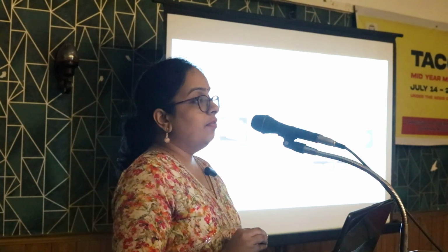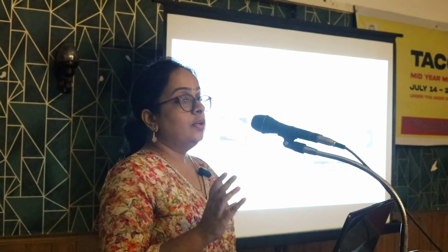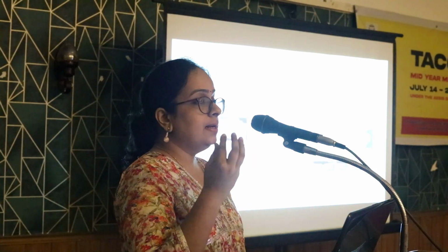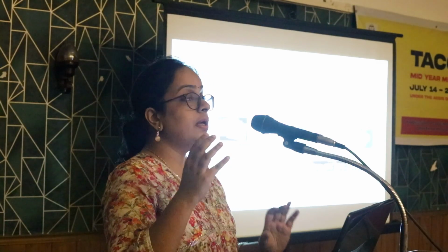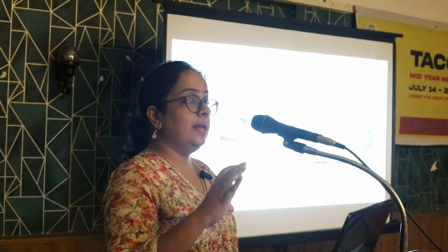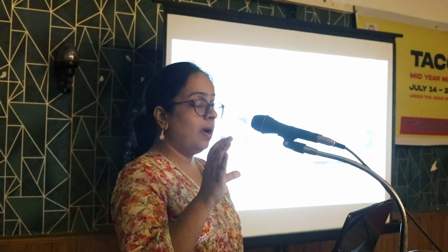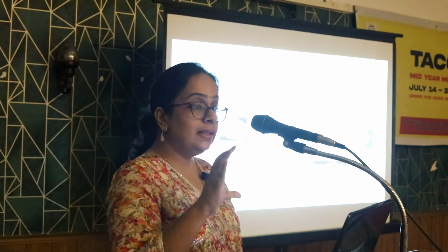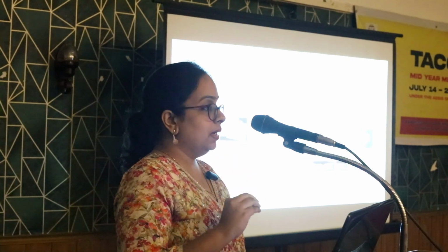The retinal nerve fibers are the axons of the ganglion cells. So, if there is any destruction of the nerve fiber layer, there can be destruction of the ganglion cells or their axons. These ganglion cells are mainly situated at the macula. So, analysis of the ganglion cell and inner plexiform layer thickness at the macula can give an idea of the status of the nerve fiber layer.